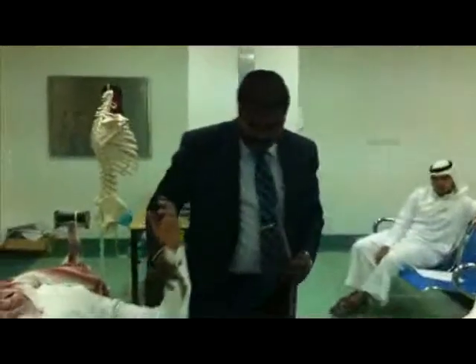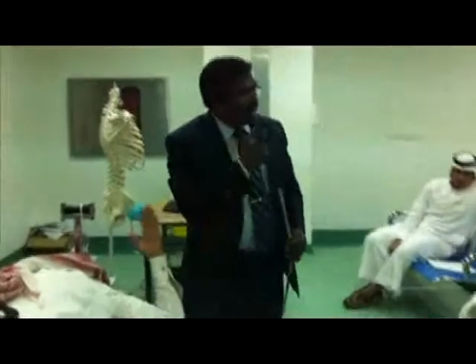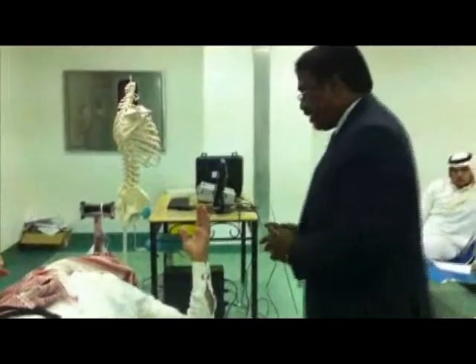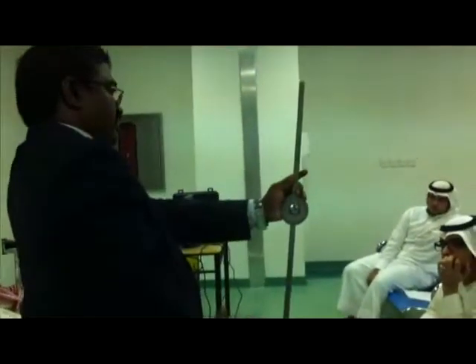Patient position supine, therapist beside the patient. For your convenience I am standing here, otherwise my position is here. Whenever you measure the goniometer, your eye level should be exactly at the goniometer — not above, not below. It should be in front of your eye so the measurement will be accurate. That's why I am bending like this.